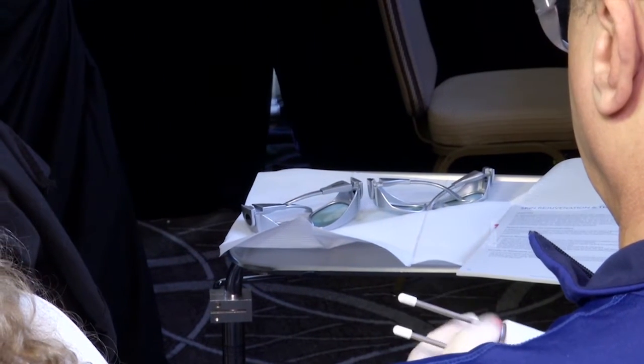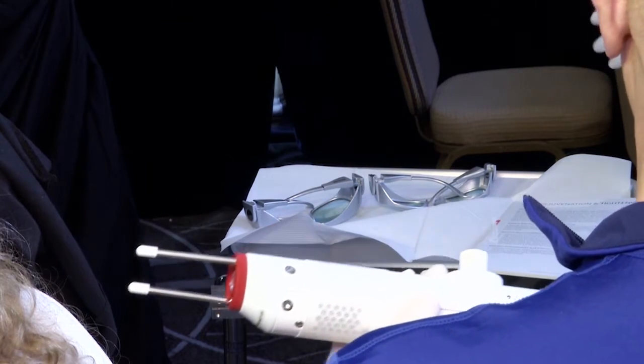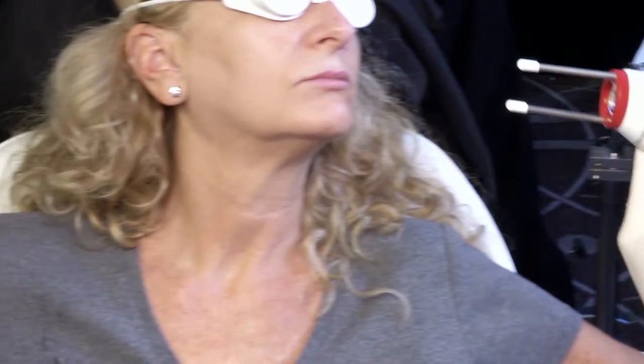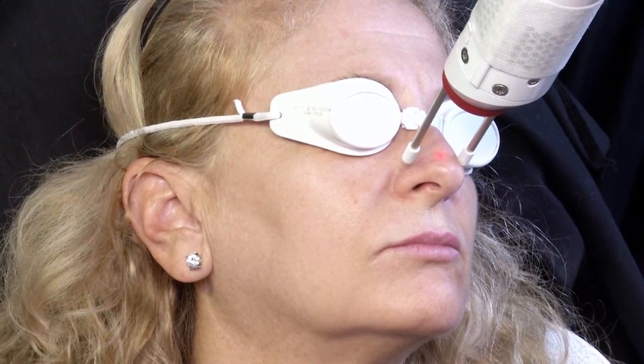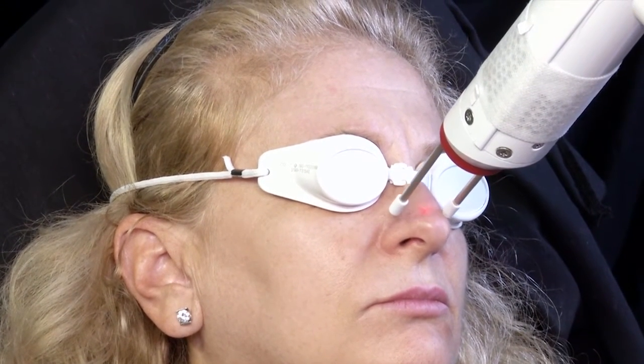We use a much smaller spot size for this because we're trying to get the fluence up and target a specific area. Same device, same wavelength, same everything — just smaller spot size. There are three different lenses; before he was using a six-millimeter collimated spot, but now using a focused lens with a spacer so you know exactly what fluence is being delivered to the skin. I've got a nice teeny aiming beam, I've got the spacer right onto her skin, and I'm going to fire. You're not going to see purpura from this generally — you might get a little bit of a blanche. And voilà.